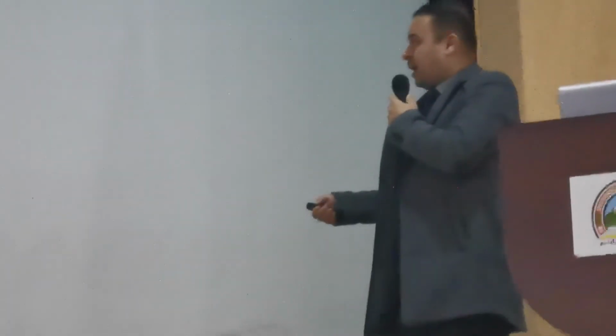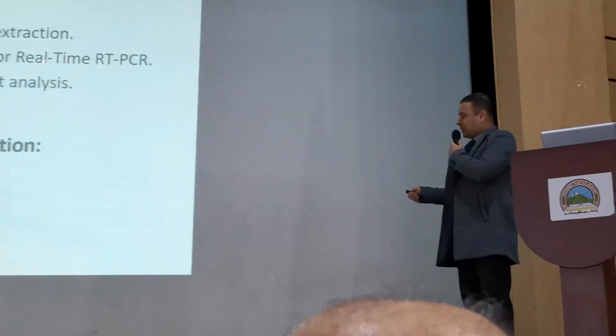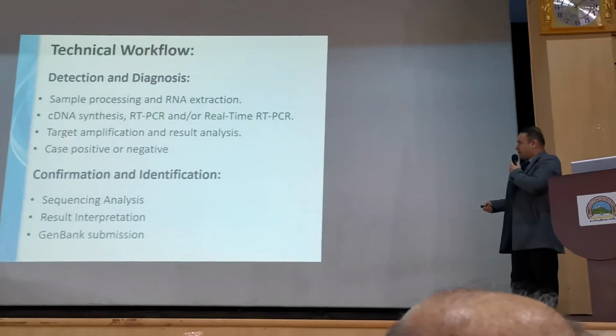The technical workflow of this procedure starts with sample processing and RNA extraction, as I told, and then cDNA synthesis for normal PCR and also RT-PCR and real-time RT-PCR for detection of positive and negative samples.